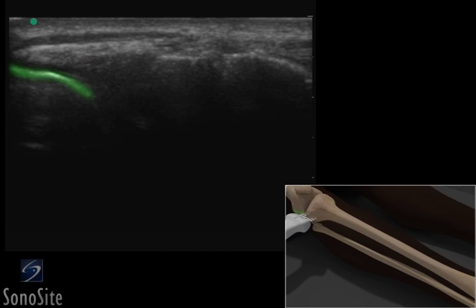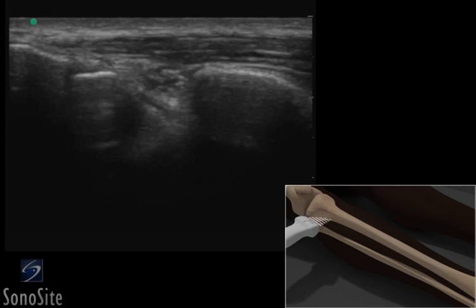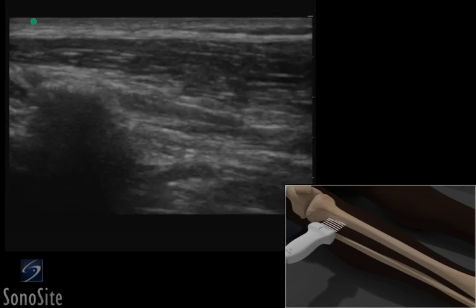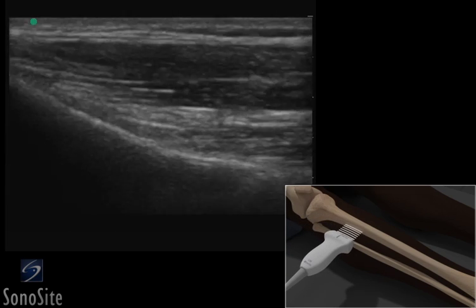The bright hyperechoic distal femur and proximal tibia are identified. The transducer should be slowly translated down the tibia to the medial malleolus. The cortical surface of the tibia is a smooth, uninterrupted, hyperechoic line without step-off deformities.